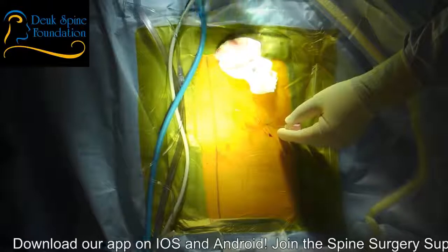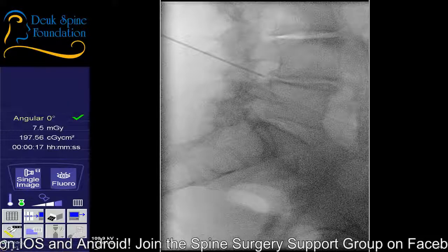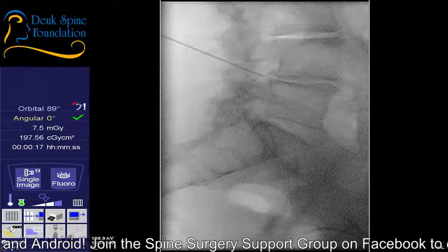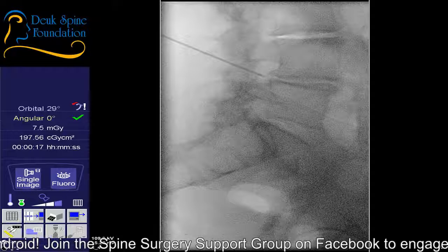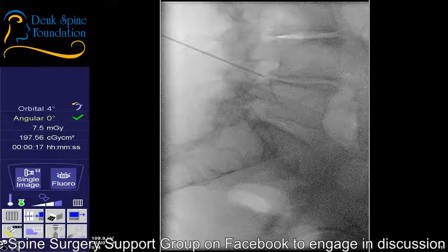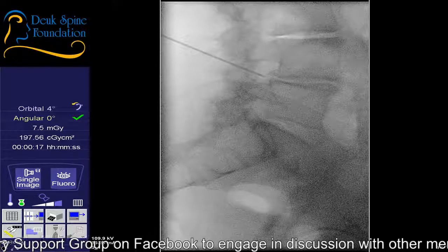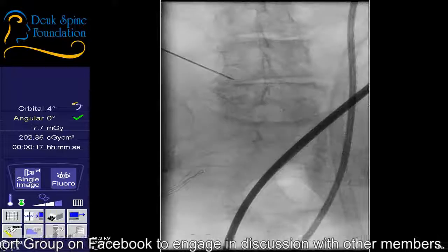Oh, I feel a big herniation there. Shot? Question is, can we get into the disc space? Let's get an AP view. I'm on the herniation. I'm literally pushing on it. Now you can't see the herniation, but it's right at the tip of the needle. The needle is in the foramen at L4-5 on the left side, left foramen. I know you can't tell that based on the lateral view. Let's get an AP view.